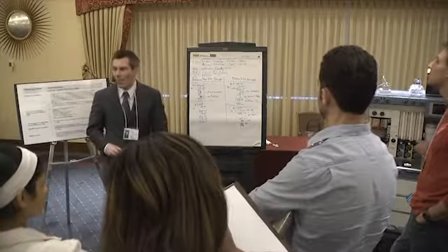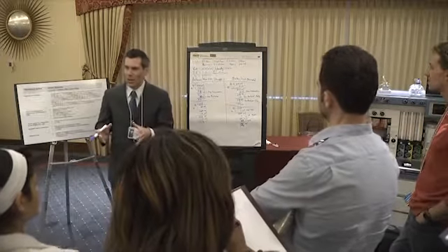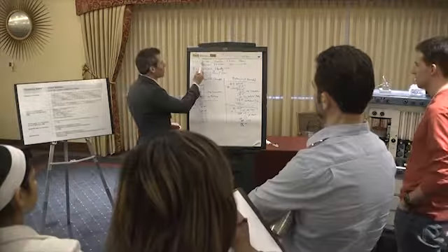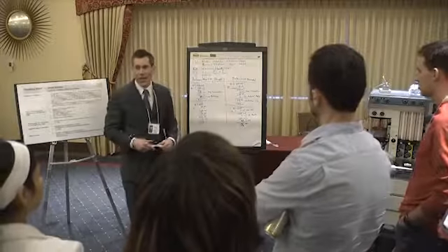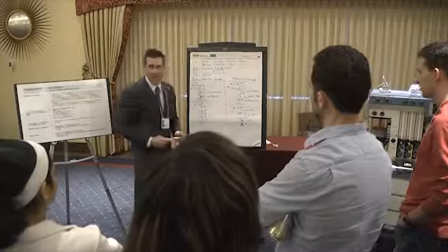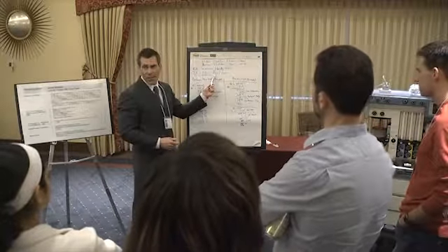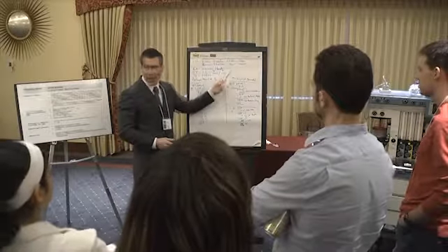A lot of it's for accuracy of ventilation. As we go through this, think about all the factors I'm going to talk about and how they affect your tidal volume to the patient. If you have a fresh gas flow of 8 liters a minute, that comes out to 133 mLs per second. If you have a rate of 10, that's 1 breath every 6 seconds. With an I:E ratio of 1 to 2, 2 seconds of it is I and 4 seconds is E out of that 6 seconds.